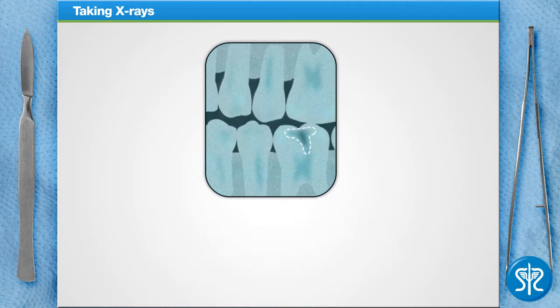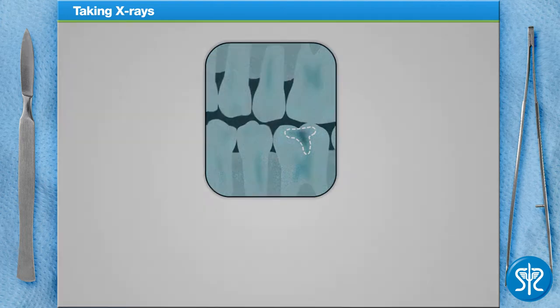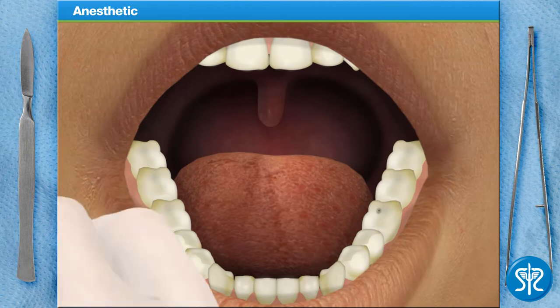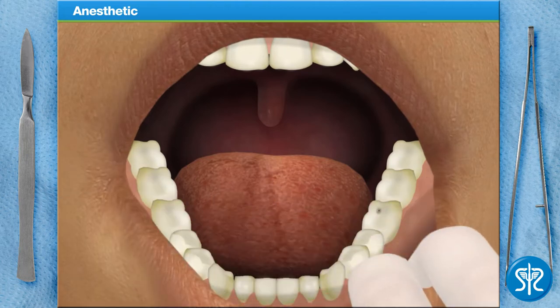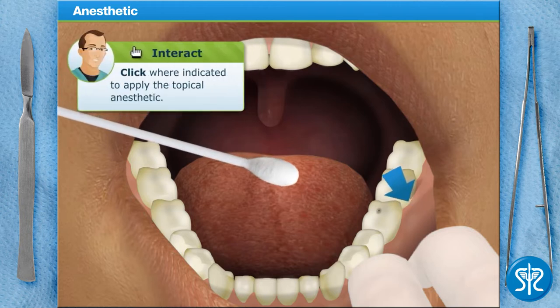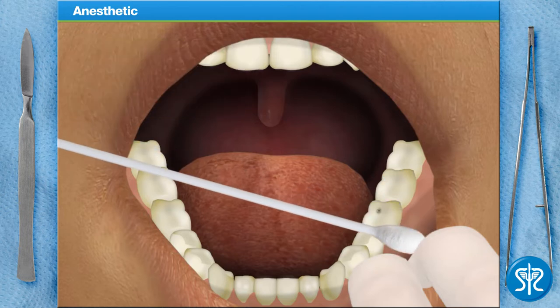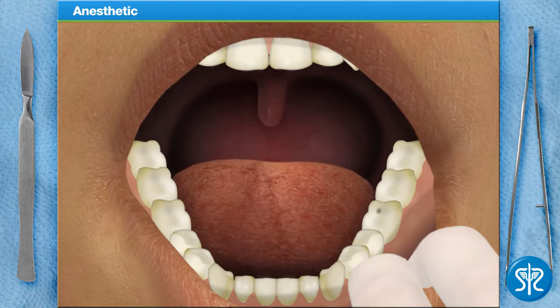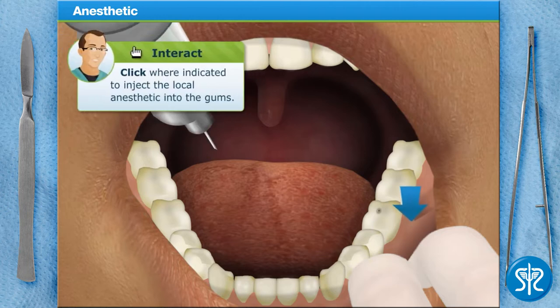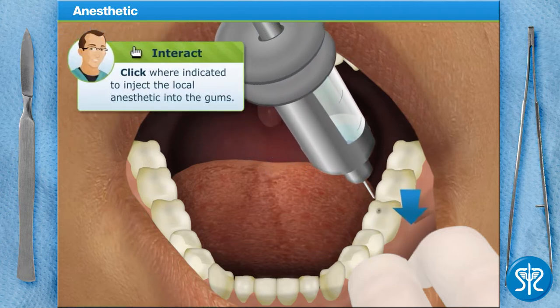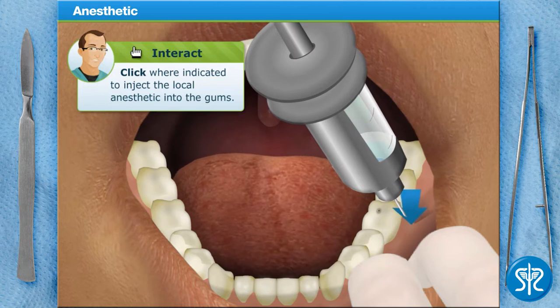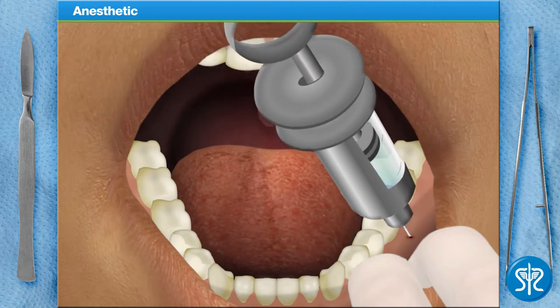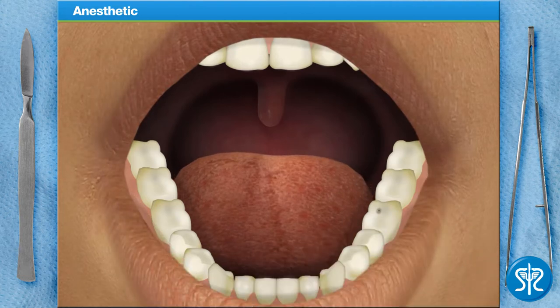There it is — we need to get that taken care of as soon as possible. Now that you've identified the cavity, we need to apply a topical numbing gel to the anesthetic injection site to help reduce any discomfort the needle may cause. Next, we can administer the local anesthetic. The patient will at most feel a slight pinch; afterward, the area will become numb for hours, even though the procedure will only last a few minutes. Take the syringe and inject the local anesthetic into the patient's gums just below the tooth we'll be working on, and now we'll give our patient a few minutes to become completely numb.